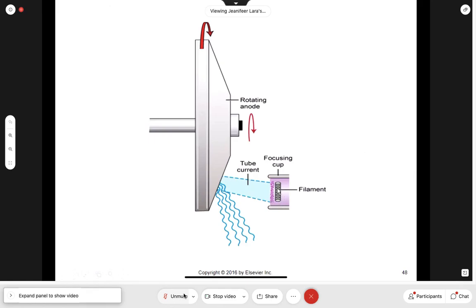It is also going to create thermionic emission. Second phase, the focusing cup is going to repel, give this a little push out, as well as attract on the anode side. And this is what is going to get what was not moving into movement. Phase one: anode side, induction motor, thermionic emission. In phase two, we actually start to get current and the collision, or interactions, to happen, which we're going to learn about later.